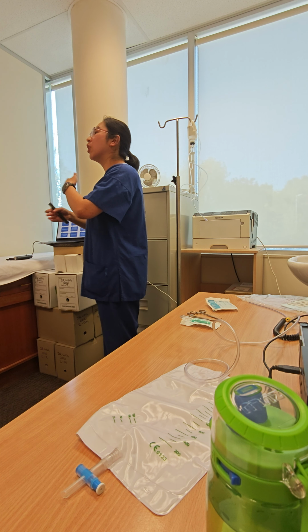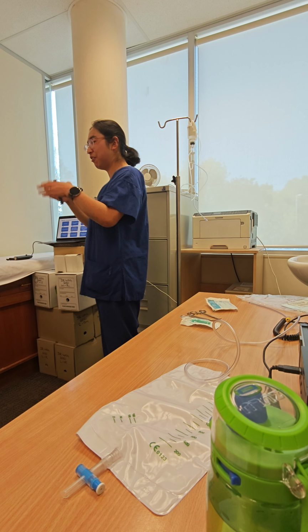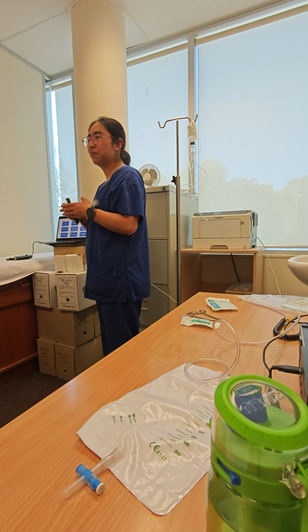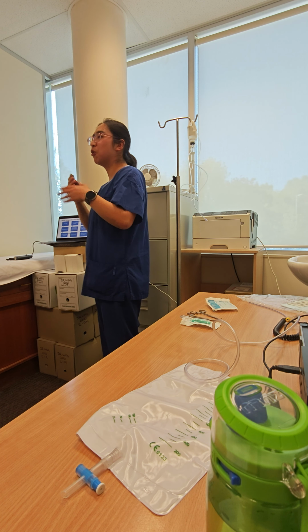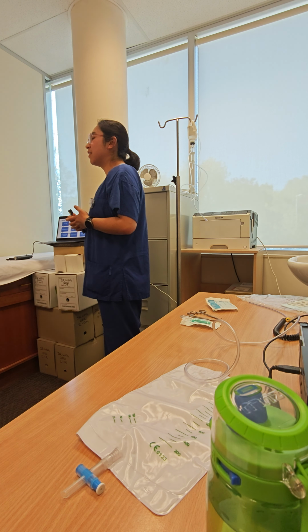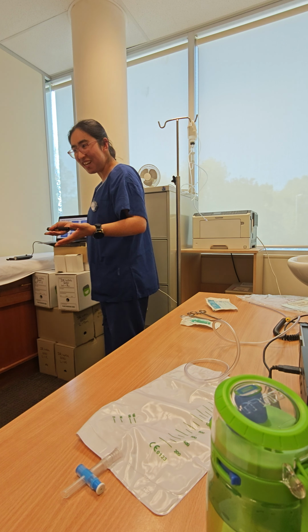We're going to tell him what's going to happen this time, especially explaining everything specifically for the first time. It's going to be easier for the second and third time. You already know what happens, so you won't be freaking out. All right, if that's good, we're going to ask him, are you happy to proceed with your procedure?